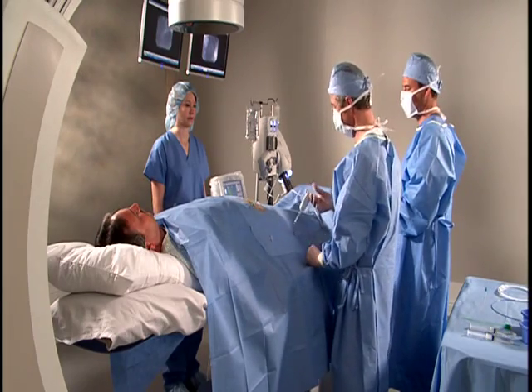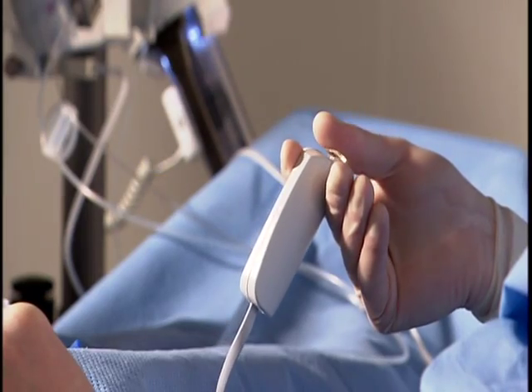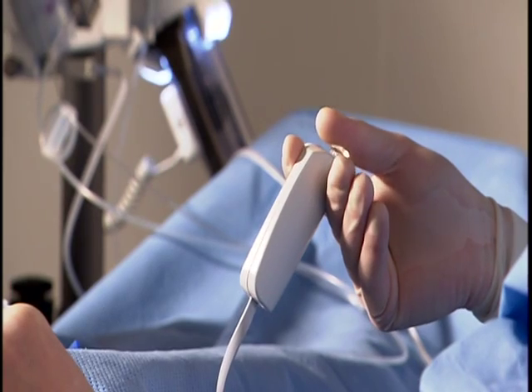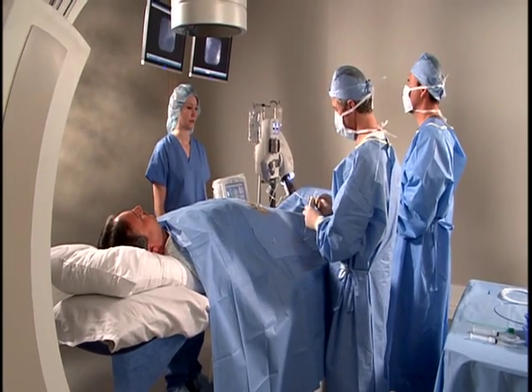In the fixed flow mode, the hand controller acts as a start switch. Simply depress to initiate a contrast injection. Release of the hand controller stops the flow immediately and disarms the injector.